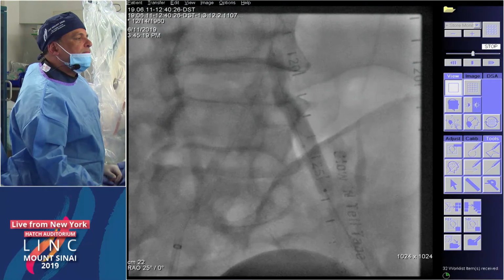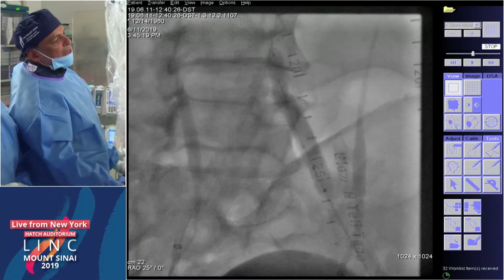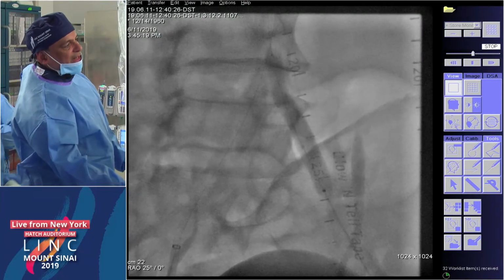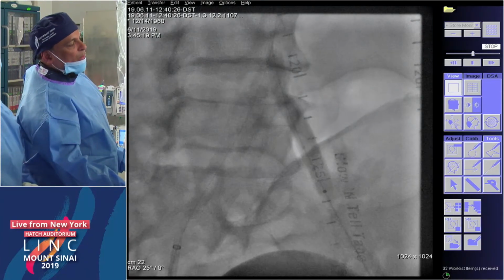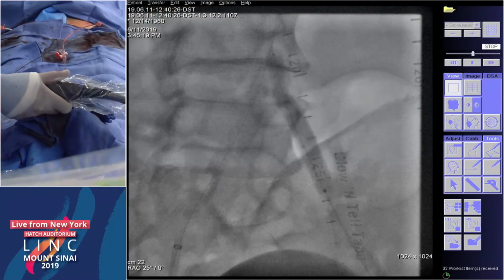Would you push the middle emitter up to that focal lesion and try and crack it a little bit more vigorously? Absolutely, Jim. What we generally do, you can get up to 6 cycles. So what we do is initially we keep it at this, treat twice at this level.